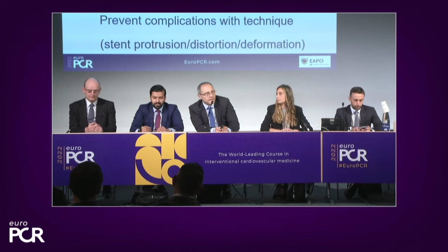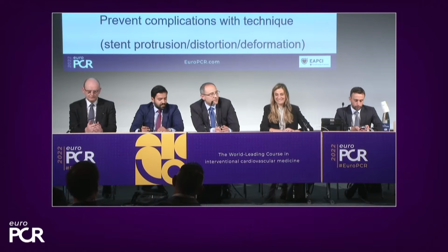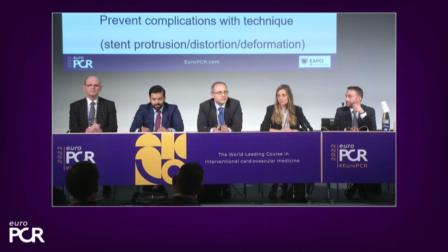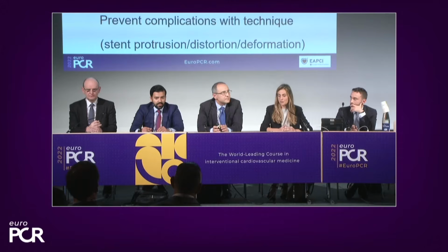Correct. For you, Valeria, in Rotterdam, where is IVUS a must? Well, I think if we refer to registry and randomized control trial, we see still that the penetration of intravascular imaging is limited. But I have to say that we now have data, and we also learn from experience, that IVUS guidance can really guide every step of our procedure. So not only the pre-procedural planning, but peri-intervention and then post-stenting optimization.